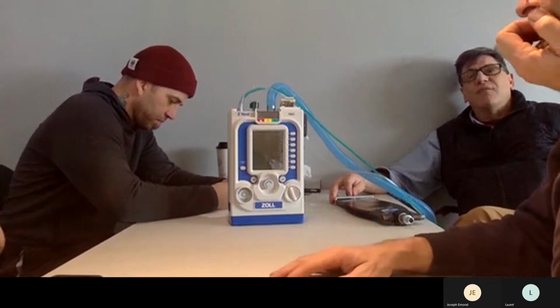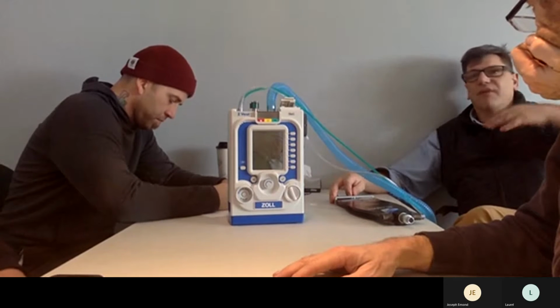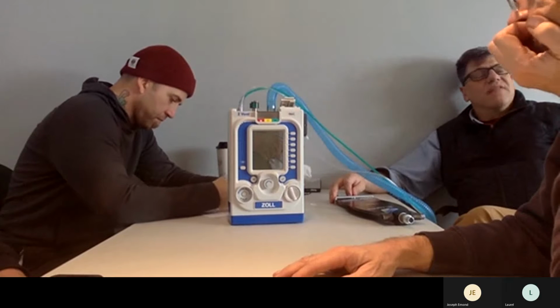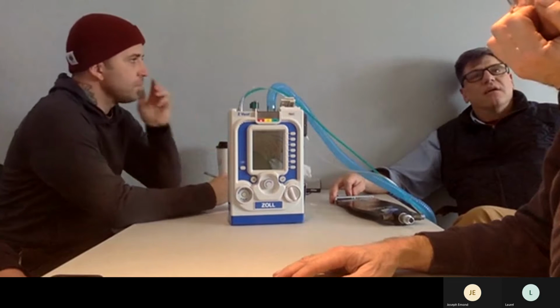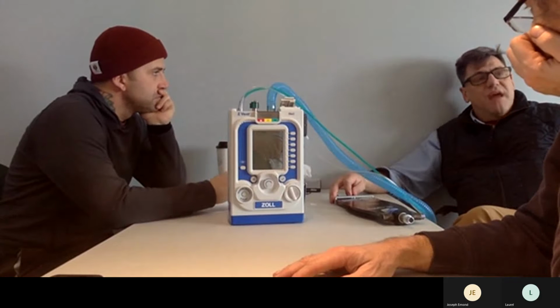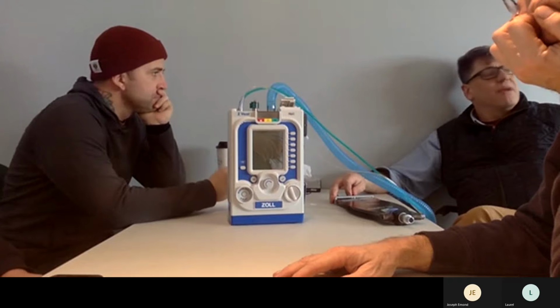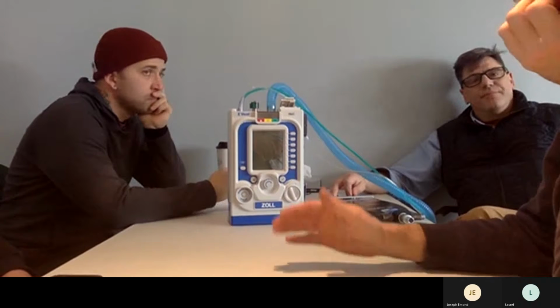Now, it won't ever be exactly 10. You'll see it at 11 or 12 because the patient has a variable rate that we can't control. If it's lower than that, it means they're getting tired. If you want 5/5 with peak inspiratory pressure of 10, you expect them to hit around 11, 12, 14. It won't be consistent.